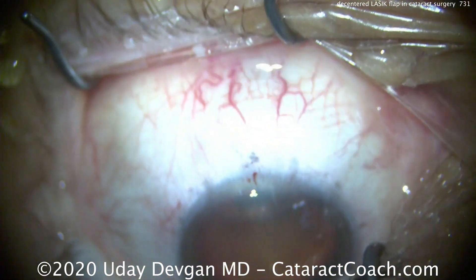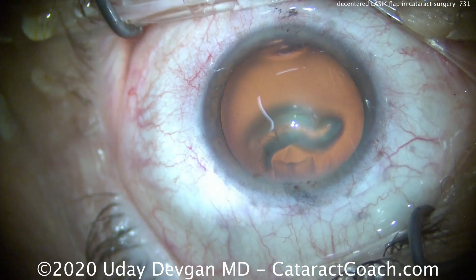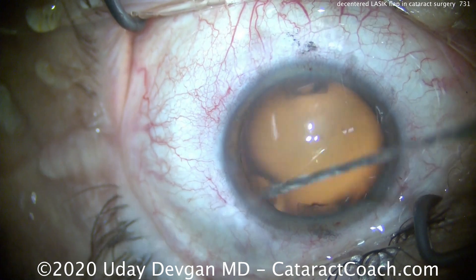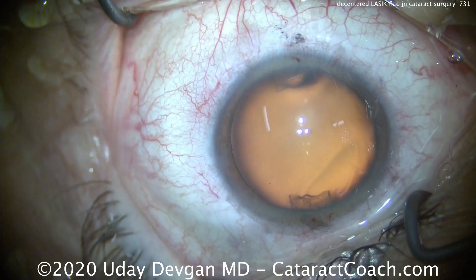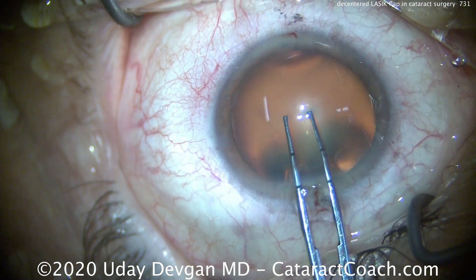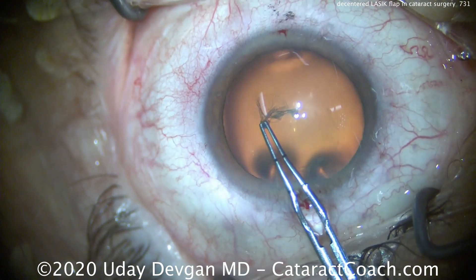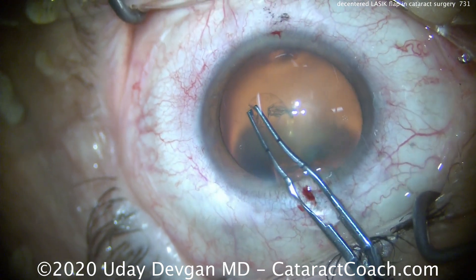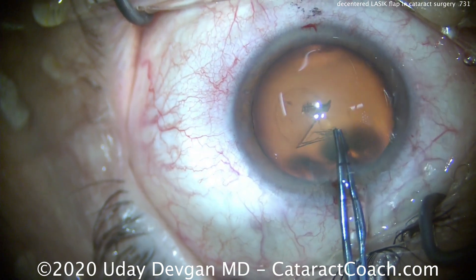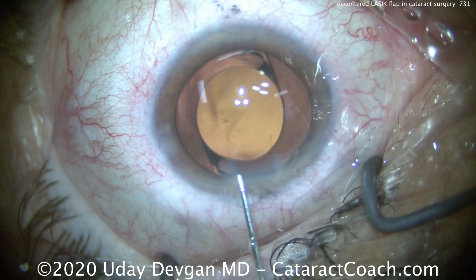We'll continue the case — everything else is going to be normal. We'll center up the eye and do our standard capsulorhexis. Remember to tell the patient ahead of time that you're not going to be able to treat all the aberrations in the cornea, because this patient has a little bit of an increased amount of irregularity that's going to be there even after surgery. Our monofocal lens won't address that. Here's the end of the case — lens in the capsular bag, it looks great, beautifully centered.